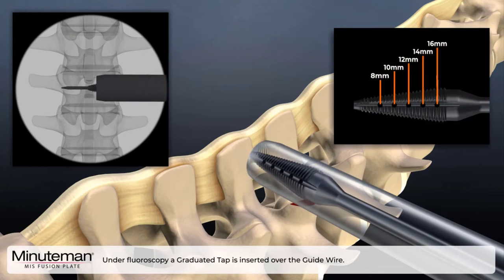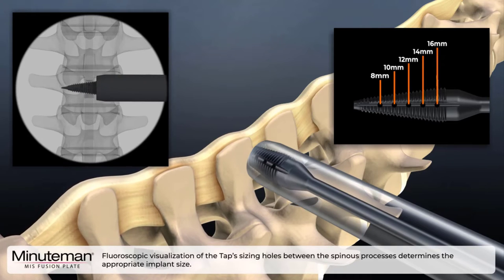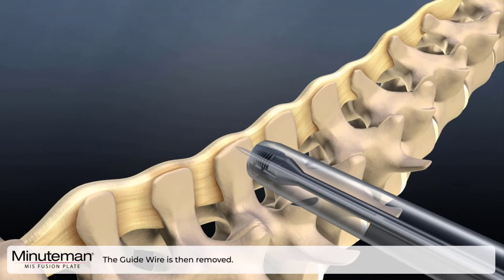Under fluoroscopy, a graduated tap is inserted over the guide wire. Fluoroscopic visualization of the tap sizing holes between the spinous process determines the appropriate implant size. The guide wire is then removed.